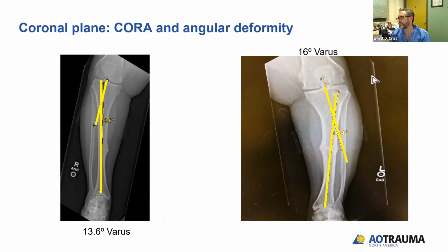Mark, any other thoughts? Mark Lee's on. Yeah, I like the nail concept for that stress fracture for sure. And I'd actually like a clamshell for this. I think you're going to be dealing with a pretty short segment, but with modern nail technology, I think that's less of an issue. So for rickets patients, especially with or without stress fractures, I certainly am trying to use an intramedullary implant. So I'm in that camp.